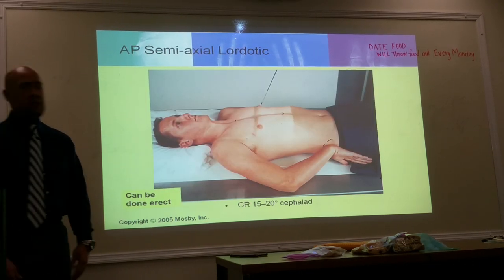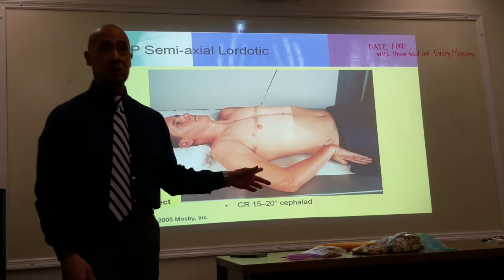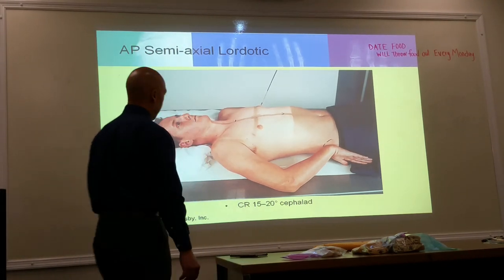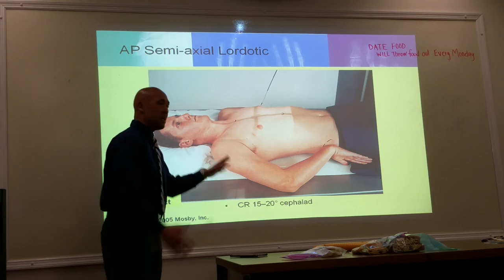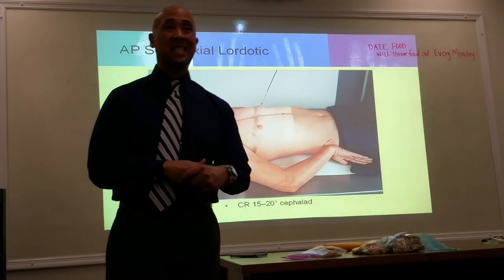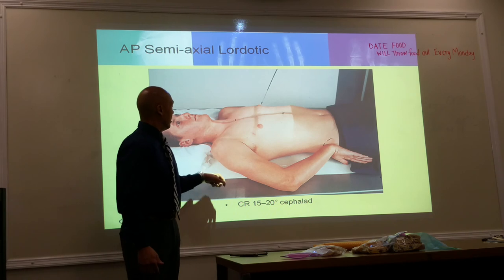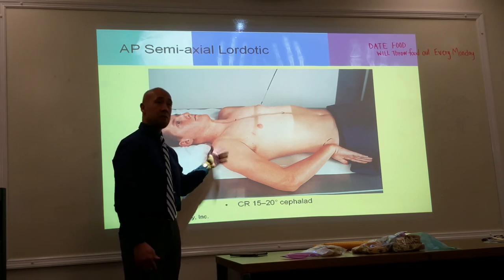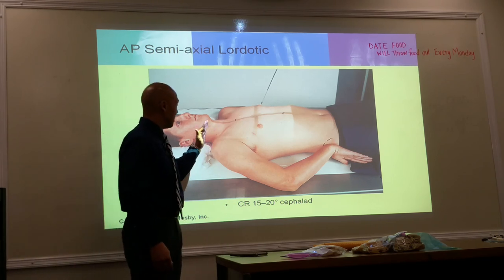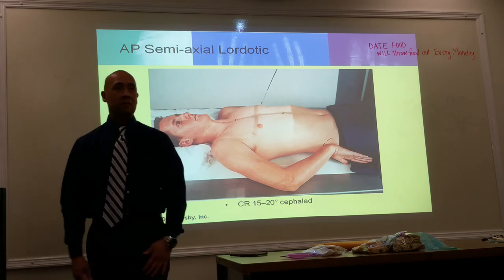All right. So this can also be done upright. Again, we prefer to do it upright. This is just a demonstration with the patient supine. Again, if you can do it upright, let's do it upright. Central ray, nothing changes. It's a chest x-ray, so we're going to center our central ray at the level of T7, finding it several ways: 3 to 4 inches below the sternal notch, 6 to 7 inches below the vertebral prominence if they were PA, or in this case, one of the easiest things to do is just place the top of your light field a little bit above the vertebral prominence.